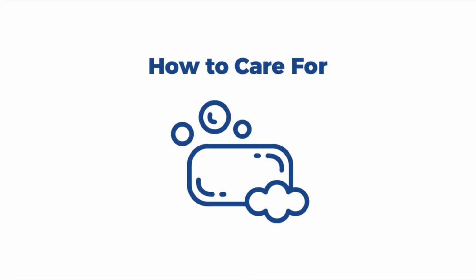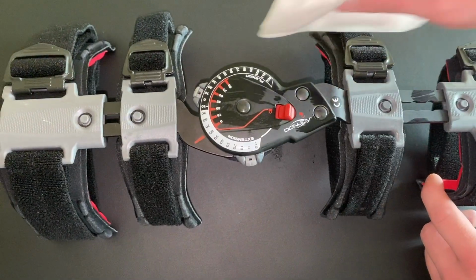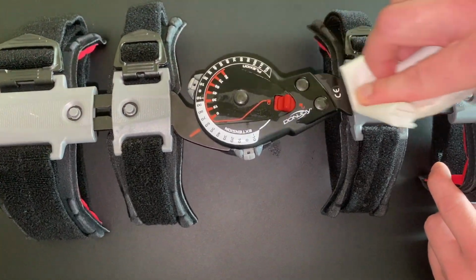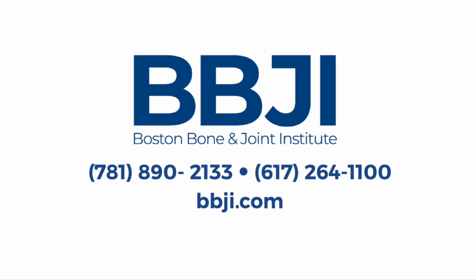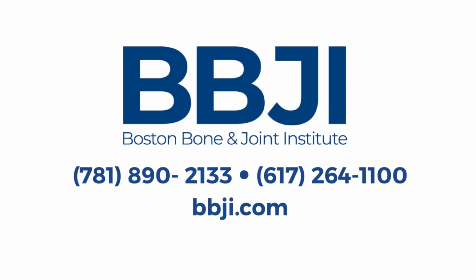To clean and care for your XROM brace, it is best to spot treat using a damp cloth. Please do not submerge the brace in water or use a washer and dryer. If you have any additional questions regarding your brace, please refer to your postoperative protocol or contact our office.